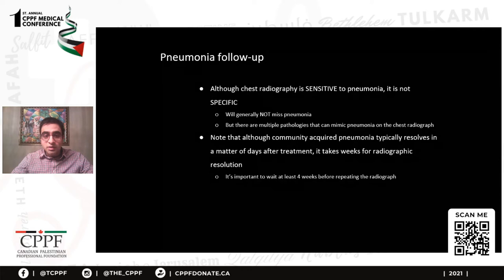Community-acquired pneumonia typically resolves in a matter of days with the appropriate treatment, but it takes weeks for radiographic resolution. And so it's important to wait some time after treatment and after resolution before repeating the radiograph. Repeating the radiograph about a week after the initial diagnosis is useless. It's probably going to look exactly the same. Typically, we recommend 6 weeks, but the minimum period that you have to wait is 4 weeks.